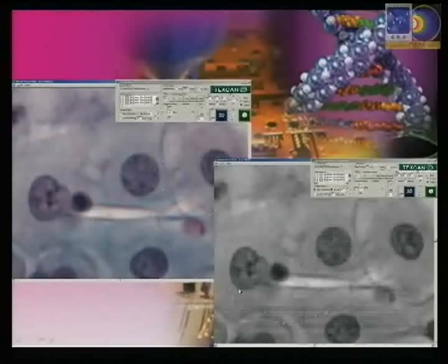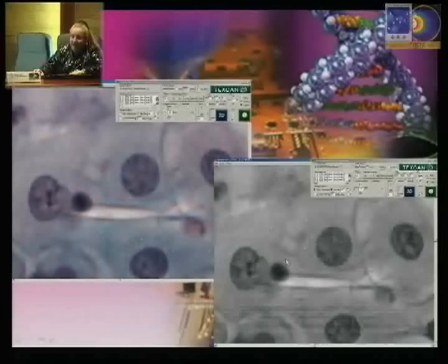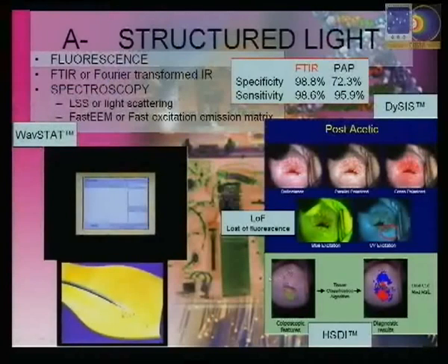As you can see here, the detail is better seen in the black and white image than in the color image. The reason is that the color image is a combination of the four pixels around, and therefore you lose some of the details, and this decreases the contrast that we have been talking about.